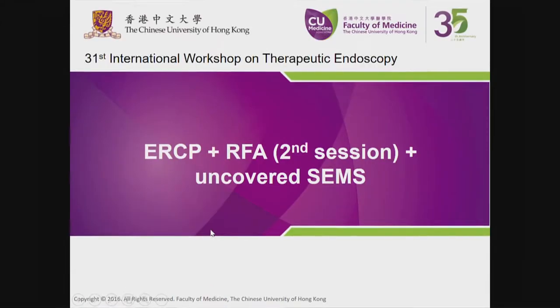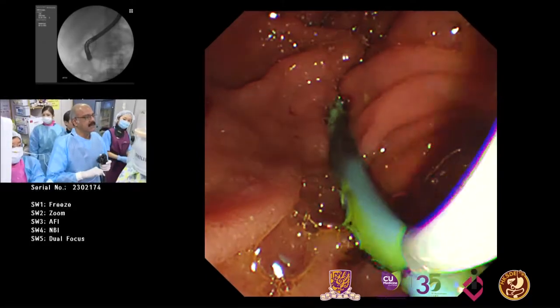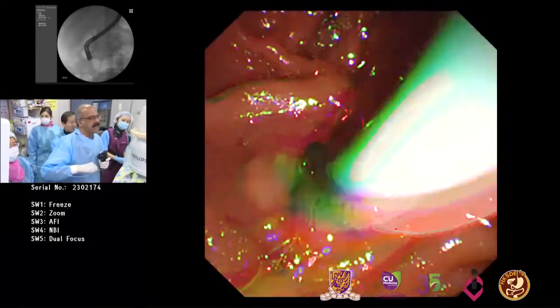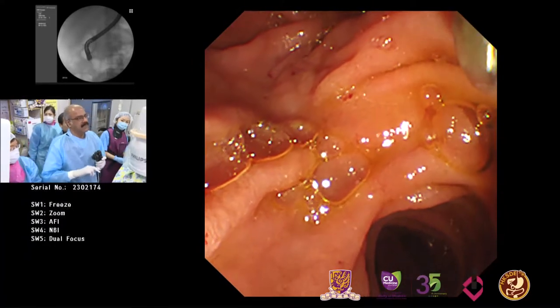So this gentleman is here today for ERCP and RFA for the second session, and also an uncovered self-expandable metal stent insertion. So we start this procedure by removing the plastic stent. The duodenum is a little deformed, as you'd expect from pancreatic cancer, and there was some difficulty in getting into the second part of the duodenum.